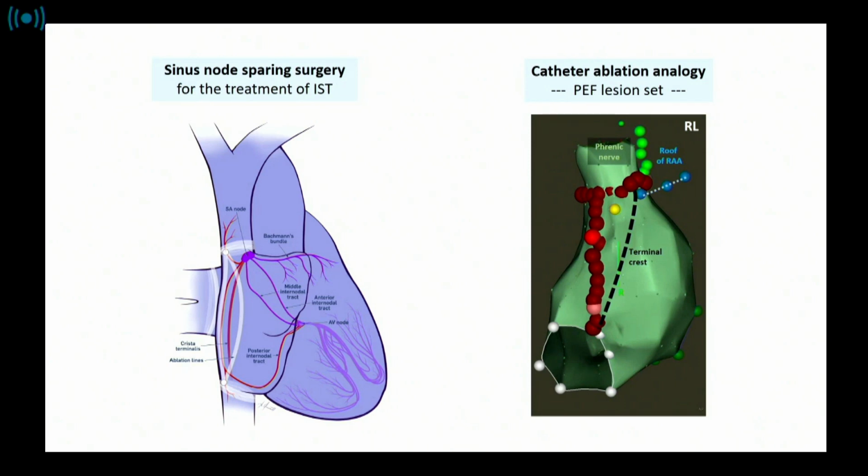And at this region, the thickness of right atrium is not so thin. So in roughly 50% of patients, even after repeated attempts to ablate the sinus node endocardially, it is not possible, and epicardial approach is needed. And we believe that we are able to penetrate with energy deeper than with radio frequency, especially when we are not limited by the presence of, for example, phrenic nerve.